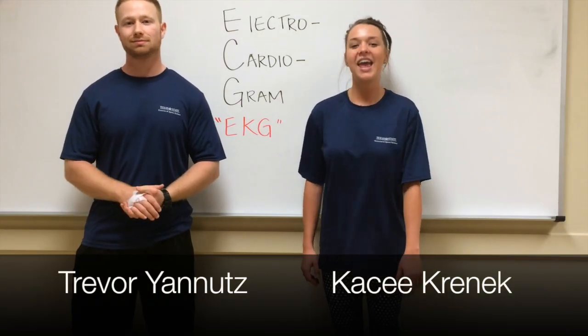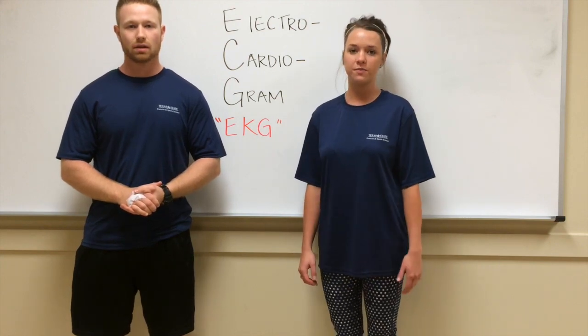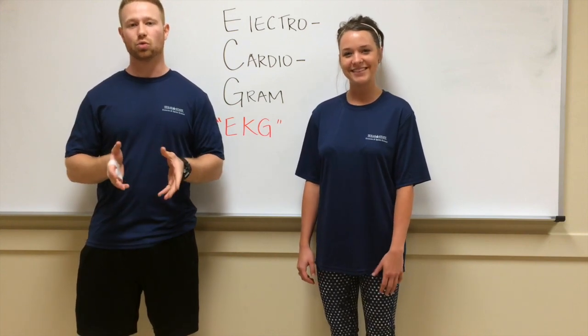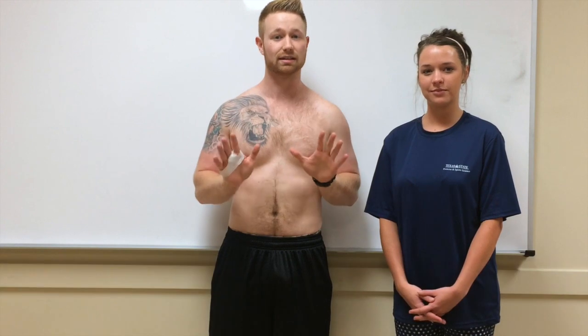Hi, I'm Casey. And I'm Trevor. Today we're going to be showing you how to do an electrocardiogram, also known as the EKG. The EKG is a really great tool to use for identifying common heart arrhythmias within individuals. Despite the fact that it's called a 12-lead EKG placement, it actually only consists of 10 electrodes.